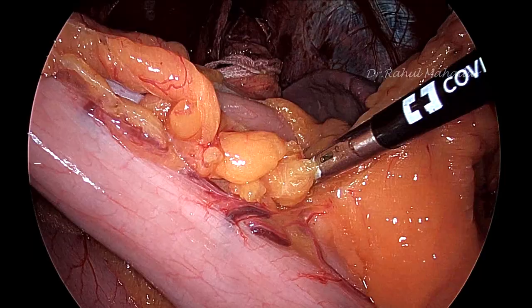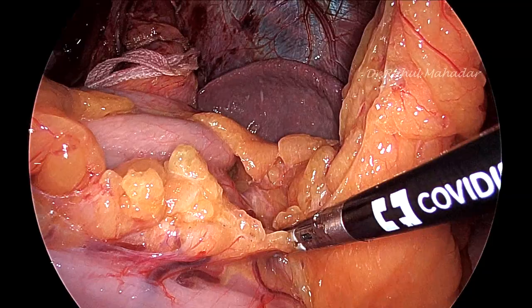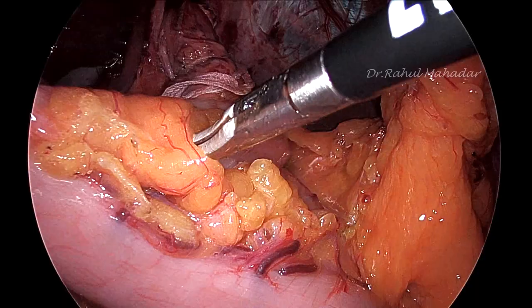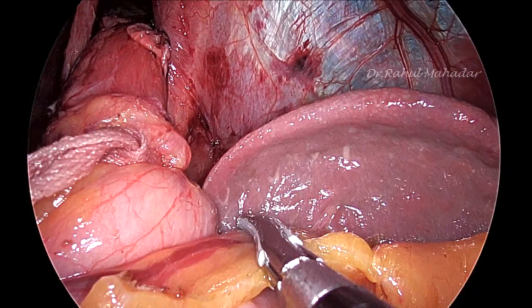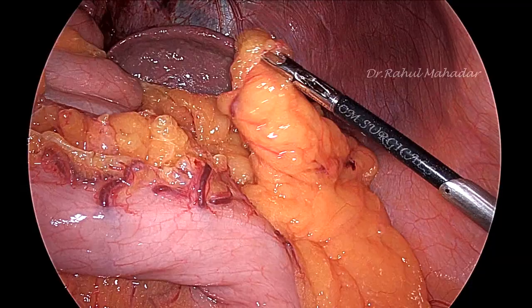Avoid bleeding in this area, otherwise the field becomes quite messy. Now the short gastrics near the spleen, you have to be very careful here. If bleeding starts in this area, then it becomes very difficult to control that. Technically very demanding. So you have to be very careful.